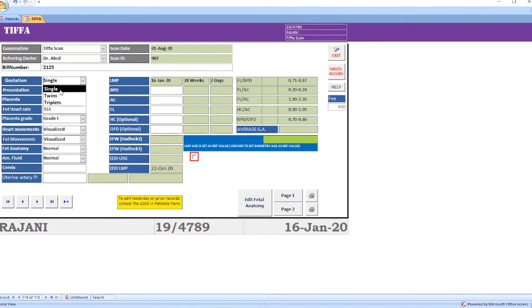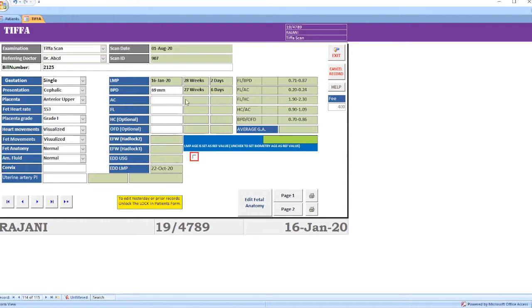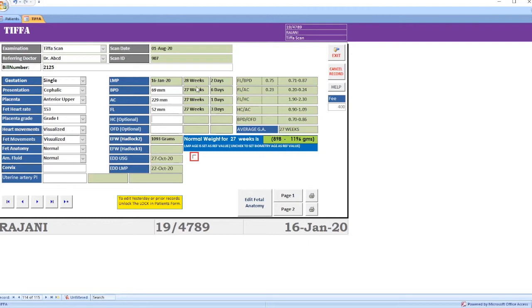In the gestation, select single and enter the fetal profile — fetal presentation, heart rate, placenta, amniotic fluid, etc. Then enter the BPD value — the fetal age is calculated automatically. Enter AC — the fetal age is calculated. Enter FL — the fetal age is calculated again. The fetal weight is also calculated automatically, and the normal fetal weight for this gestation is displayed here.